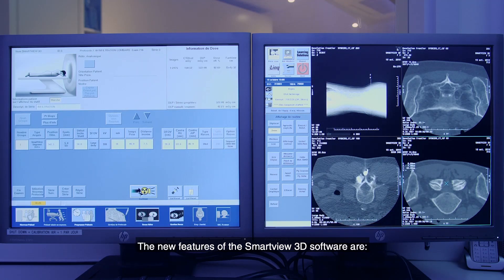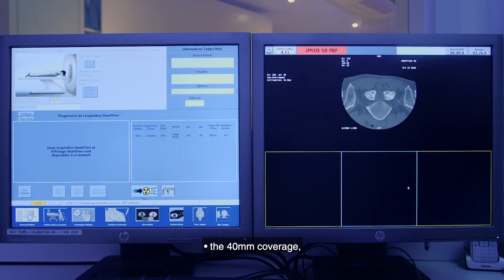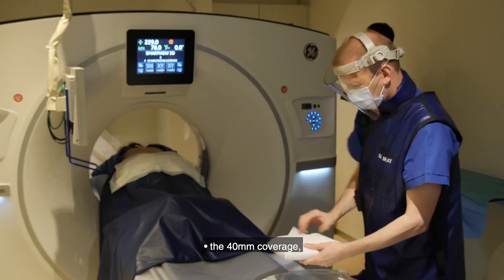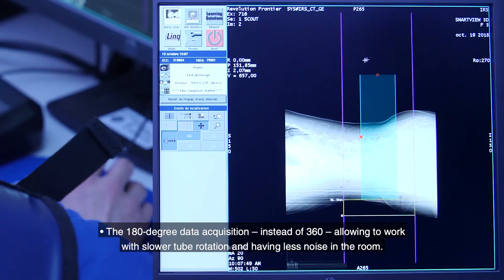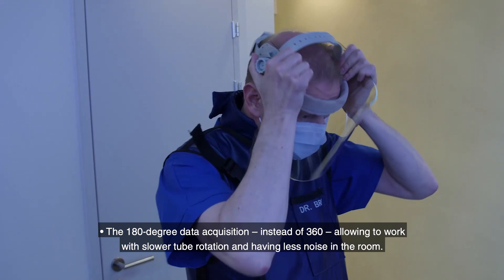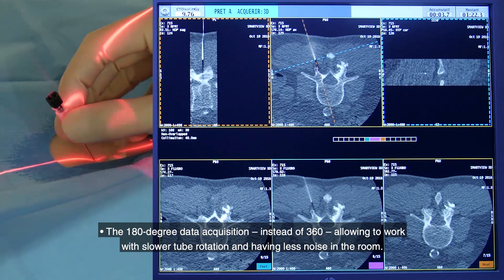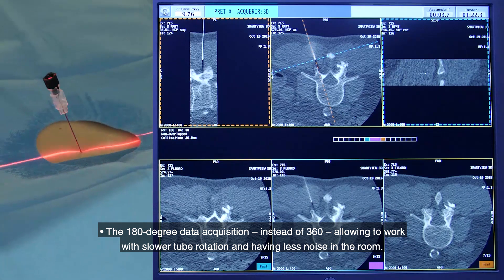The new features of the SmartView 3D software include 40 mm coverage and 180-degree data acquisition instead of 360, allowing us to work with slower tube rotation and having less noise in the room.